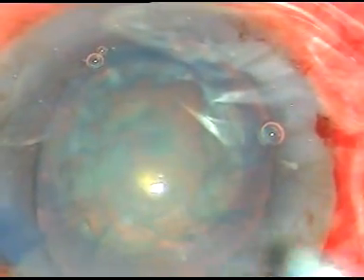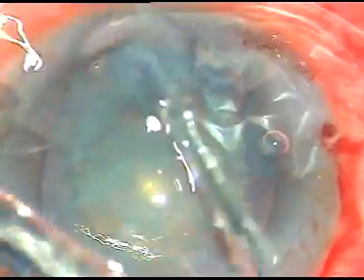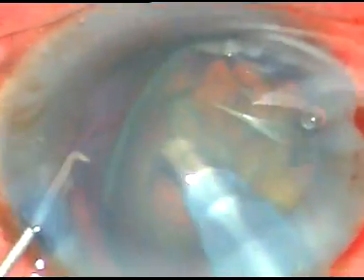This is a soft cataract and I have planned hold and tilt technique. Hold the nucleus with vacuum, tilt it, and yes, I have been able to tilt the nucleus. Here it is. And I start emulsifying the lens matter. Now see, the lens has tumbled. So it has become hold and tilt and tumble.